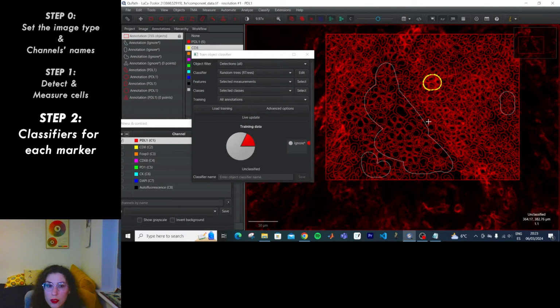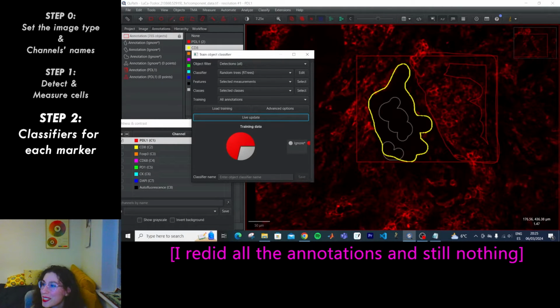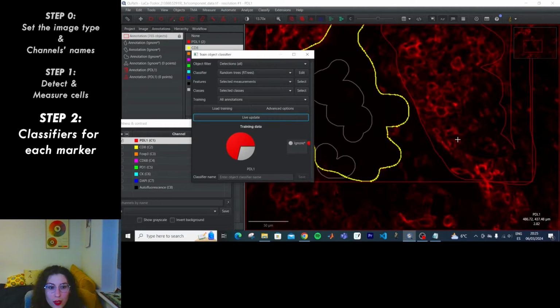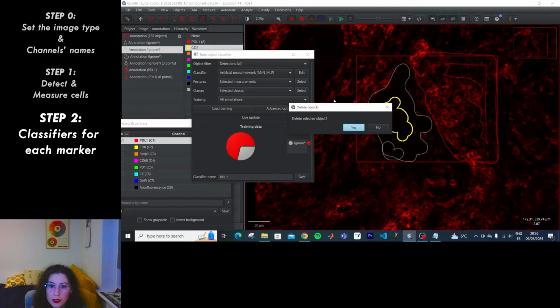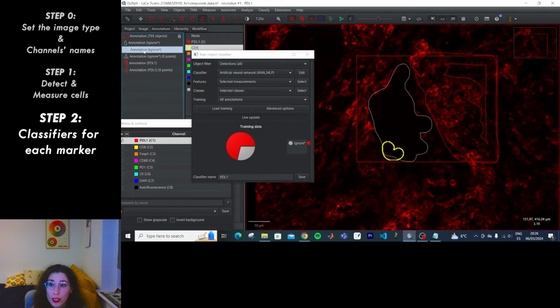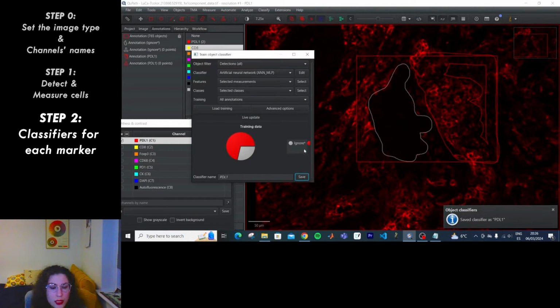And now what? Why isn't it updating? But why aren't you updating? I don't understand. What is wrong with PDL1? Well, you know what? If anyone watches the video and knows why this isn't working, please tell me. Tell us all, because I give up on PDL1. I'm going to save this classifier. Sure, yeah, override it. Why not? And I'm going to try out with a different one.